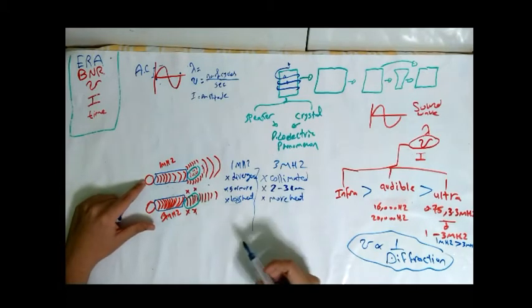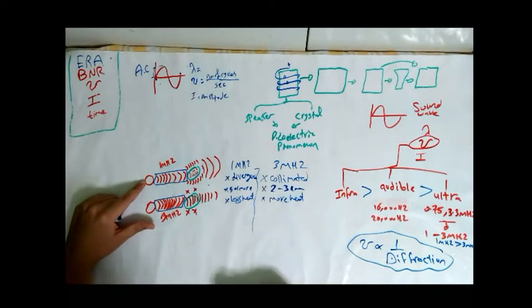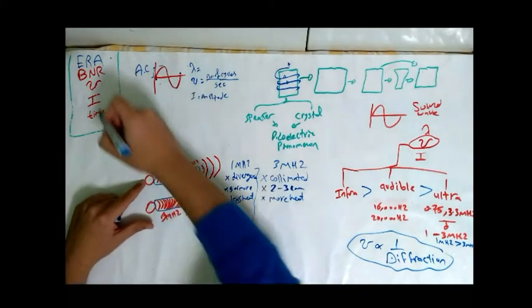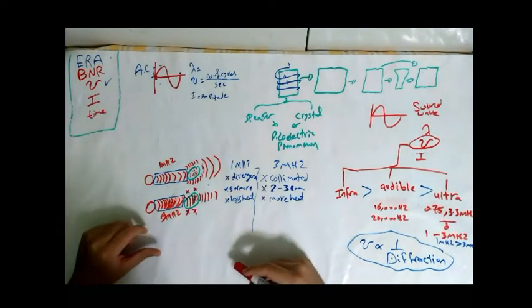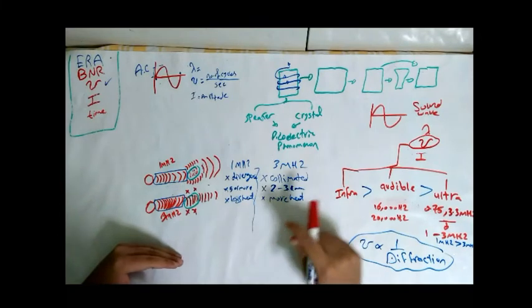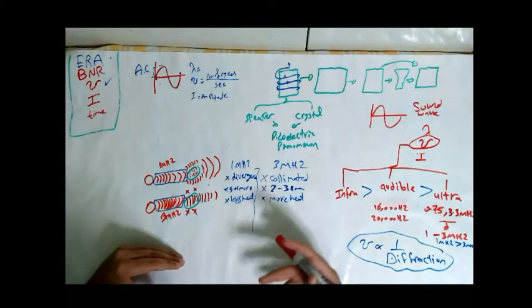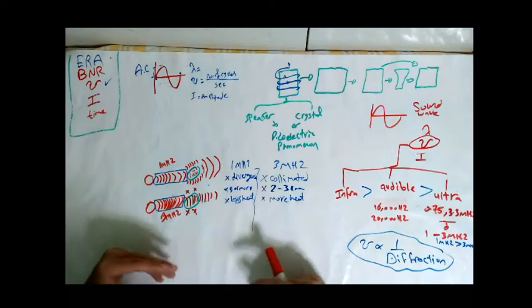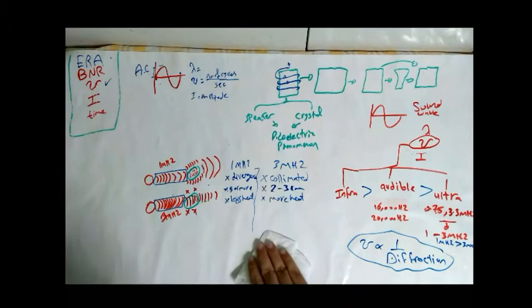This is a very important comparison because we need it when measuring the parameters of ultrasound, so we must know it. After understanding how ultrasound waves are produced from crystals, let's now see how ultrasound is propagated across the medium.